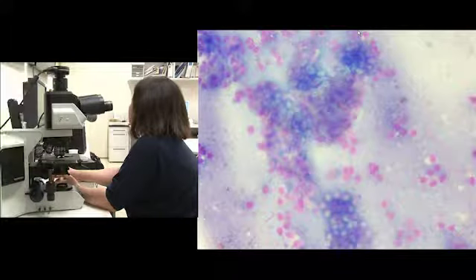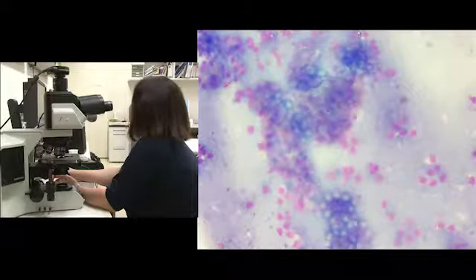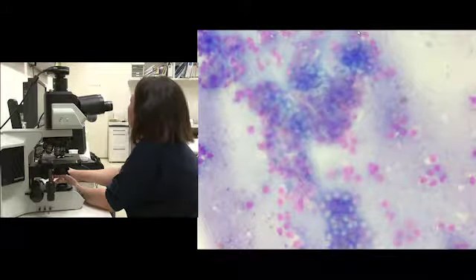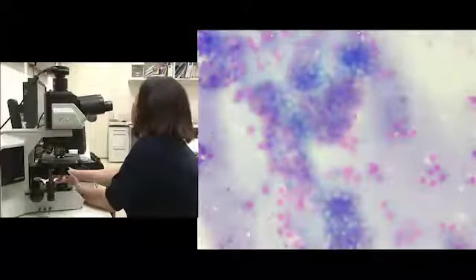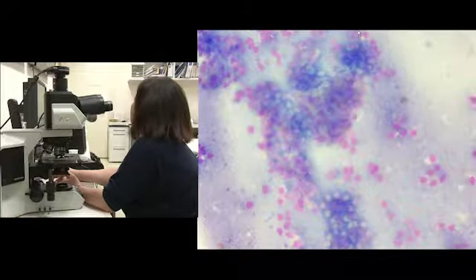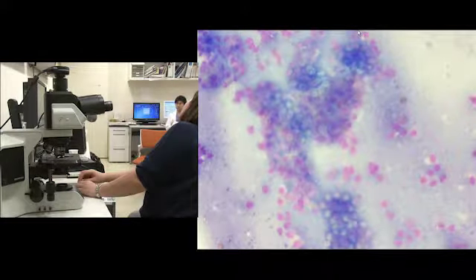Okay, on cytology, it seems that we didn't see any epithelial cells. Is that right? Lymphatic cell infiltration, no plasma cell and neutrophil infiltration. Is that correct? There seems to be not much. Is it active? Not much neutrophil seen on the slide. No neutrophils, minimal neutrophils, mostly lymphocytes seen.